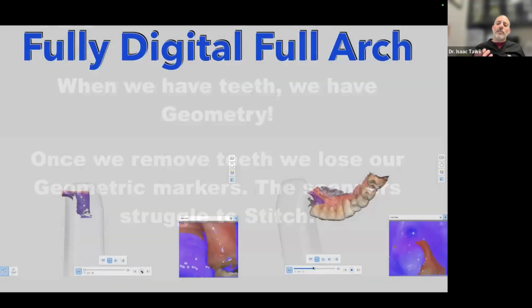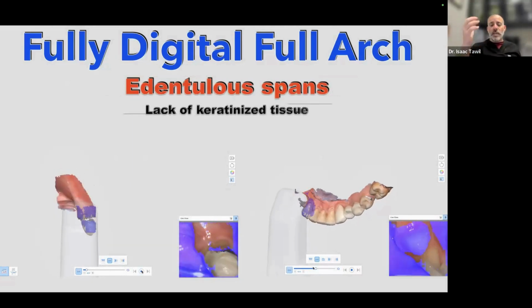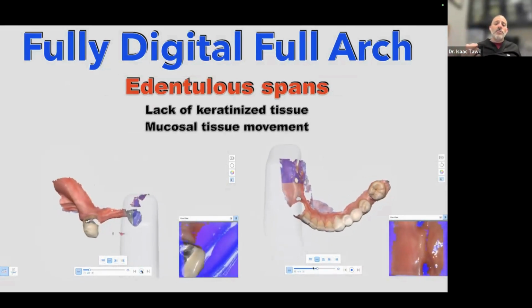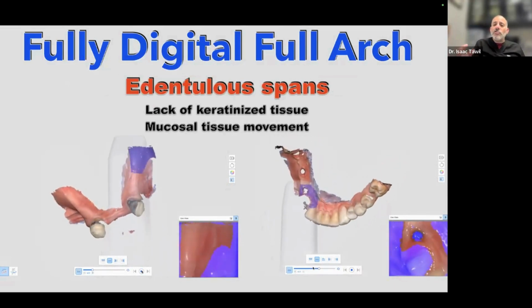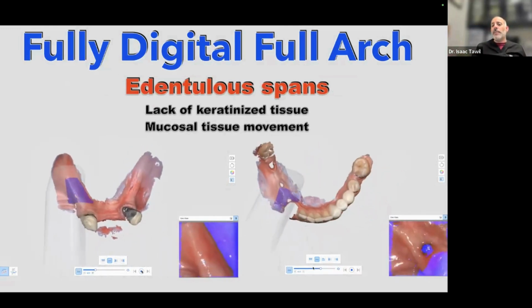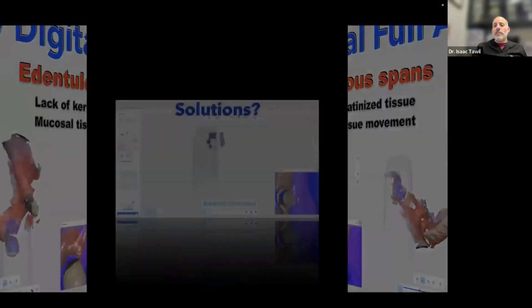We try to scan, and I was on a team. I don't want to say the scanner's name, but I was on the development team for the scanners that you're seeing here. And we realized once we lack keratinized tissue, everything gets very hard. Can it be done? Yes, but I have to go slow and struggle. I need something that will capture quickly and accurately. And that becomes a problem, especially when it comes to full arch scanning around implants.